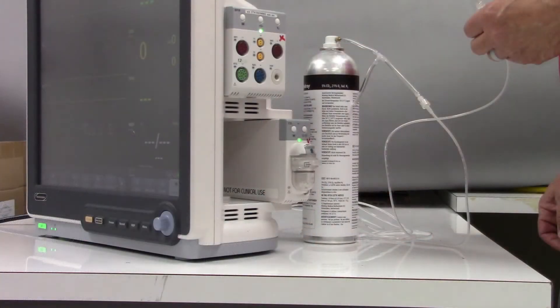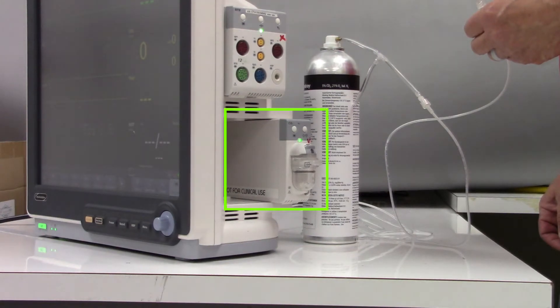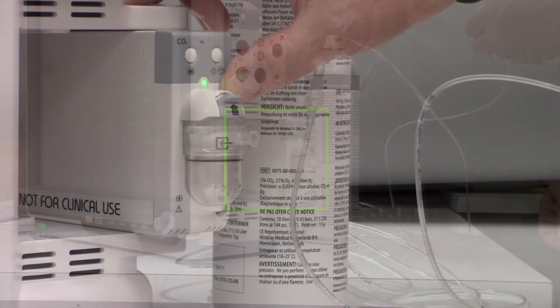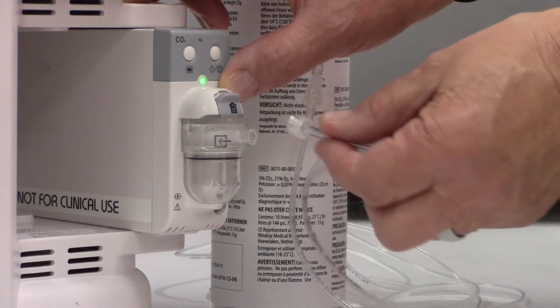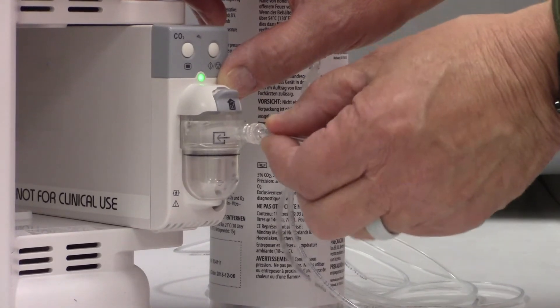Ensure your CO2 module has been installed and running in the monitor for at least 15 minutes before attempting calibration. When you are ready to begin calibration, attach the sample line to the water trap.